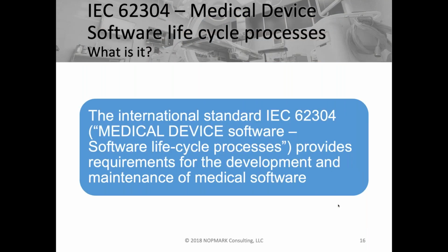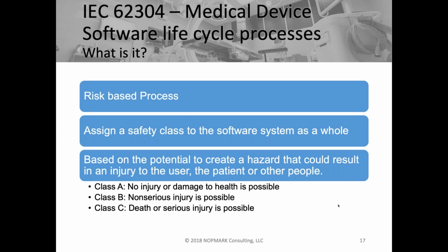So now let's start looking at the software standard itself. Within the medical device world, this is the one that drives the software development process. The specific items that cover what the developers have to do, what they have to create, and also for the testers. This standard is based on risk. It dictates certain activities that have to be performed, including software testing, based on the risk of the software system as a whole.